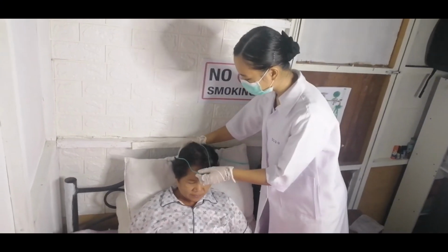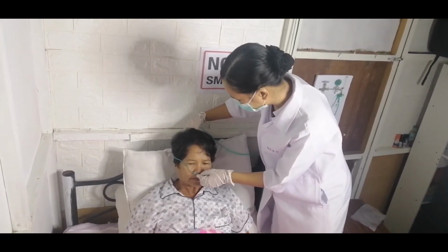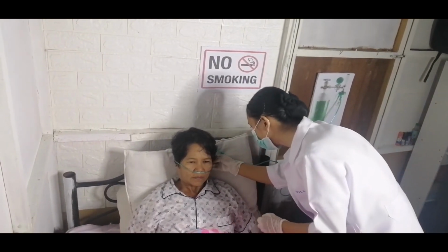Alternately, the tubing may be placed around the patient's head, with the adjuster at the back or base of the head. Then, place gauze pads at ear beneath the tubing as necessary. Adjust the fit of the cannula as necessary. Tubing should be snug but not tight against the skin.